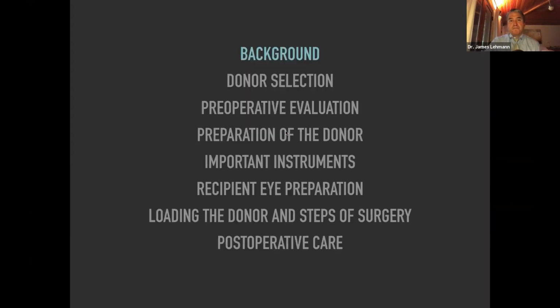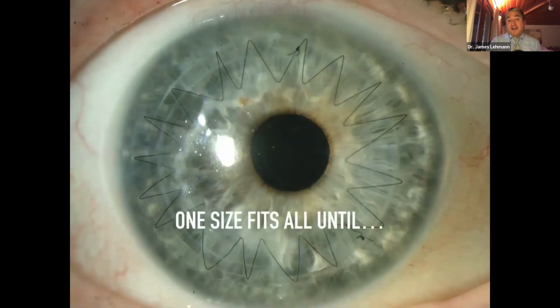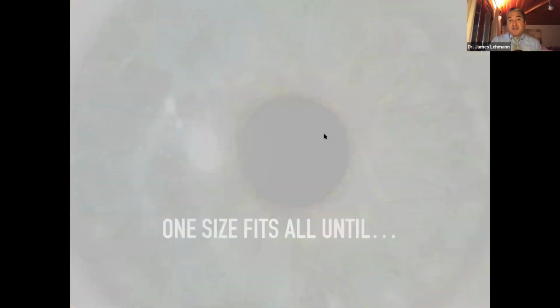All right, so background. This is what keratoplasty was in the 40s. This was Dr. Castroviejo in New York. This is a graft done with a square graft. You can see that it's not round. They used a double knife and would prepare these and use either steel or silk sutures at the time. And this is what we had for any kind of corneal disease until the early 2000s. So it was one size fits all.